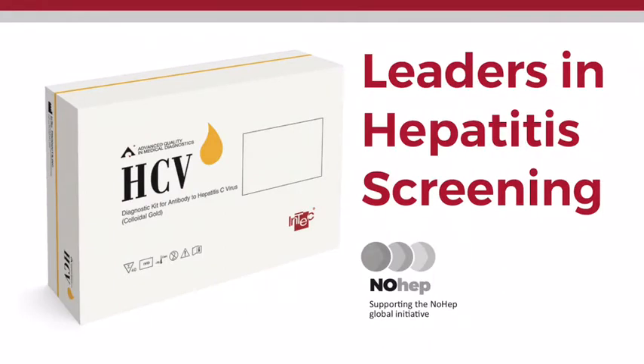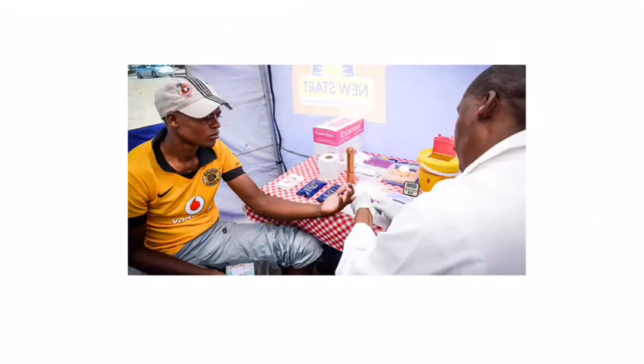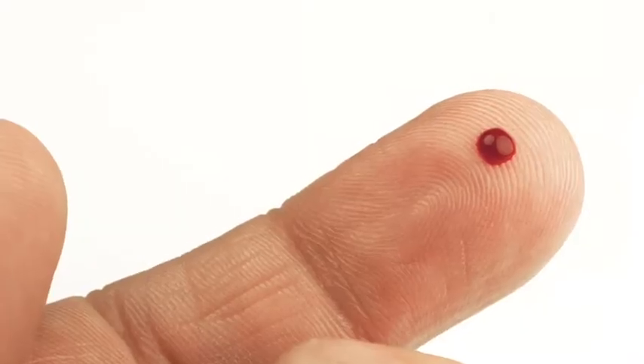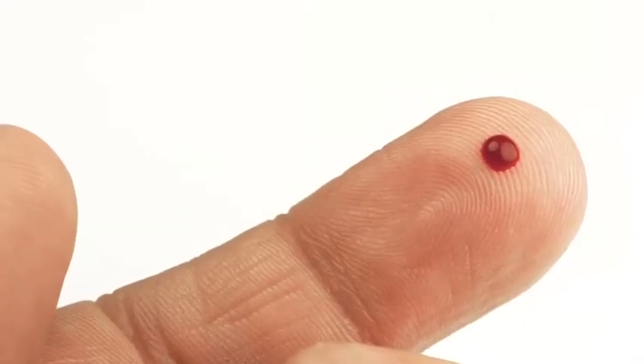The Intec HCV rapid test is an immuno-chromatographic assay that allows healthcare professionals to quickly and conveniently screen for hepatitis C virus antibody status at the point of care. The test can be performed in almost any setting in less than 15 minutes and only requires one drop of blood from a patient's fingertip to be operated.